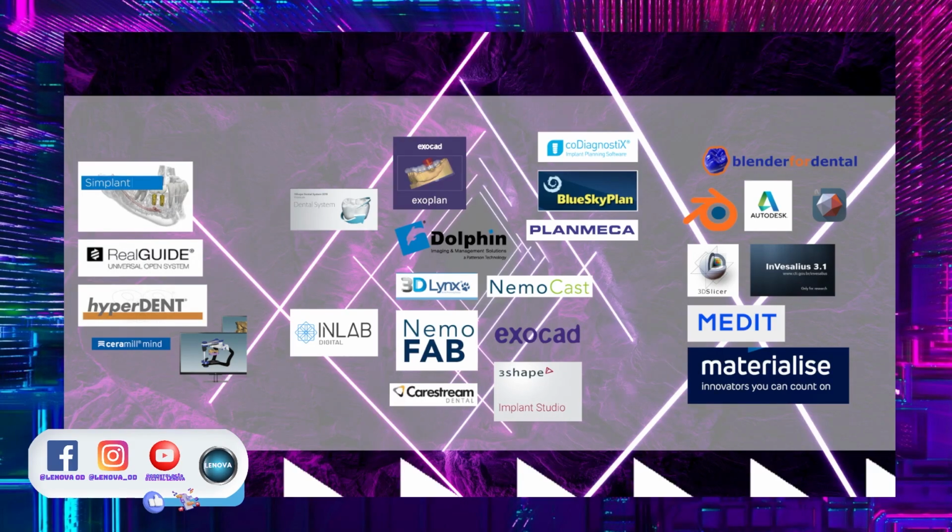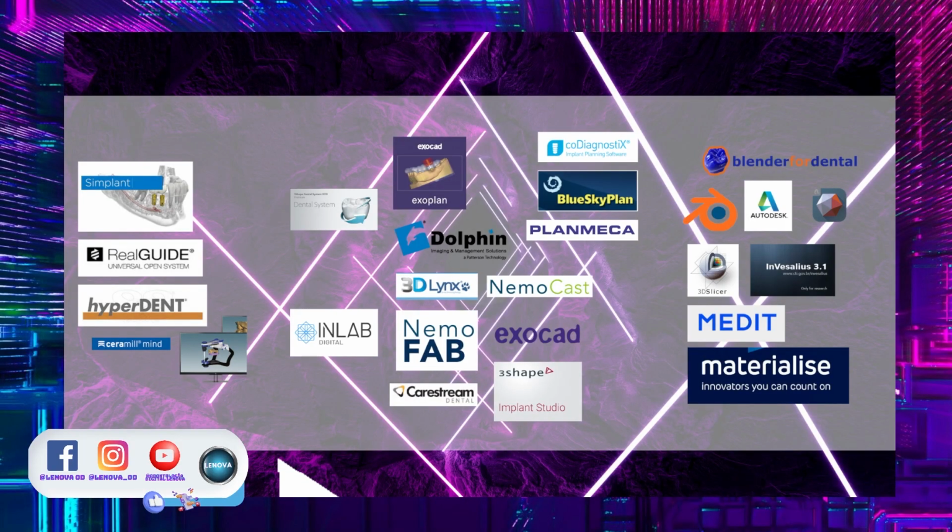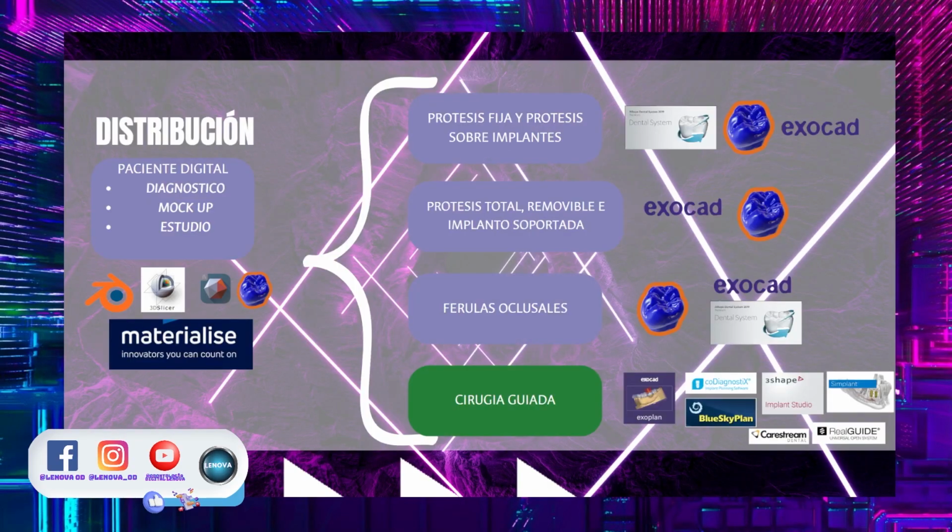They go hand in hand in the step-by-step process. We must also take into account that guided surgery also has different levels of complexity, right? So we will touch on that a little later. So this is a slide of digital workflows, the last presentation we have in the introductory talk on digital dentistry.